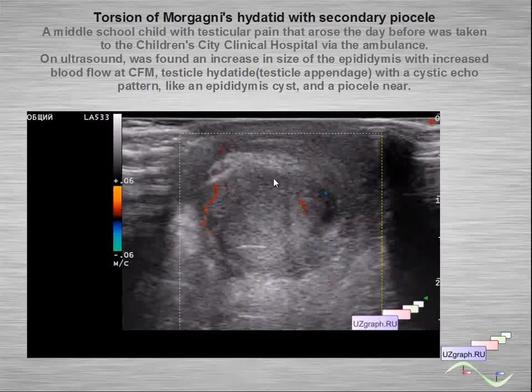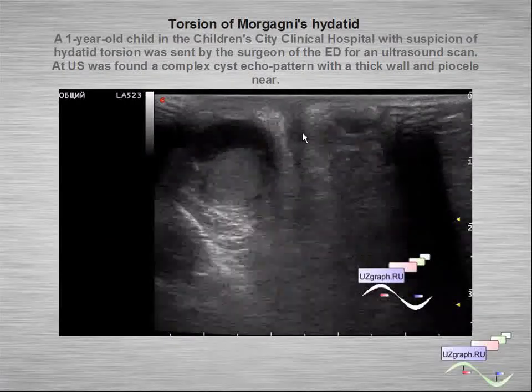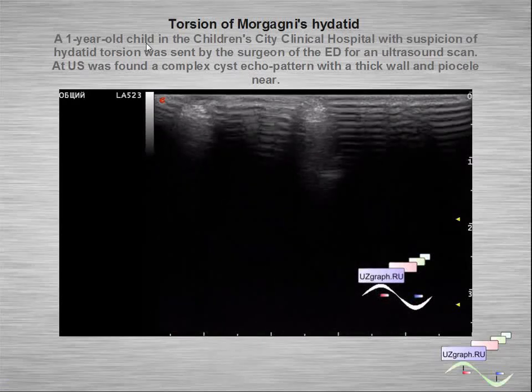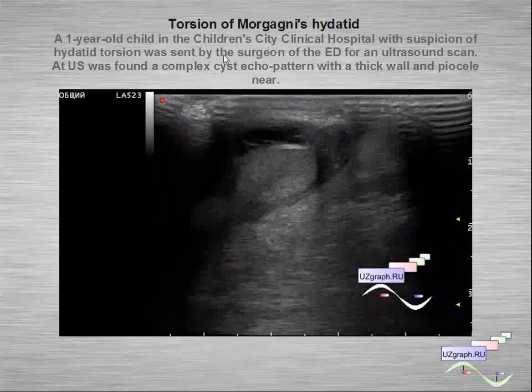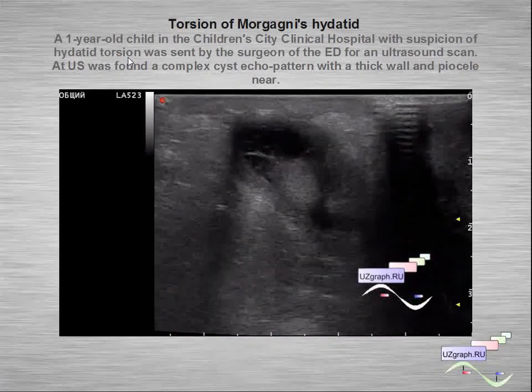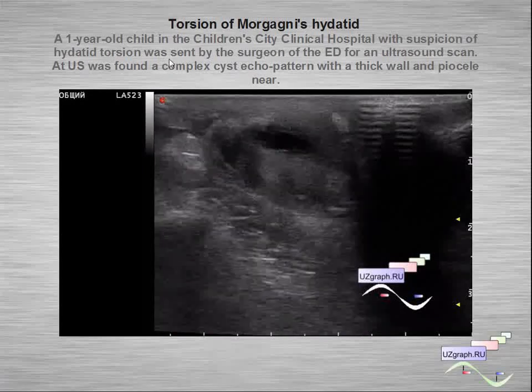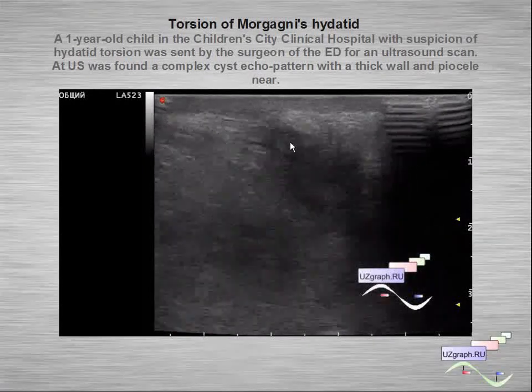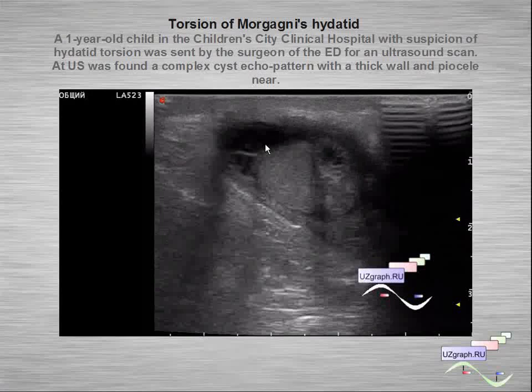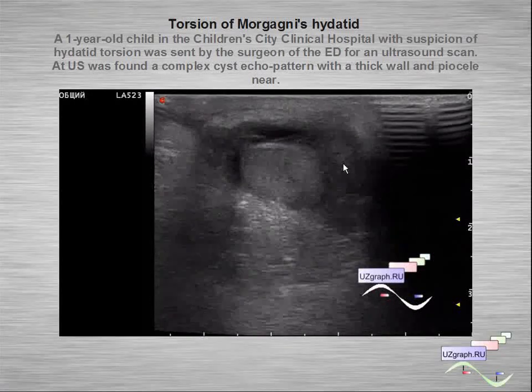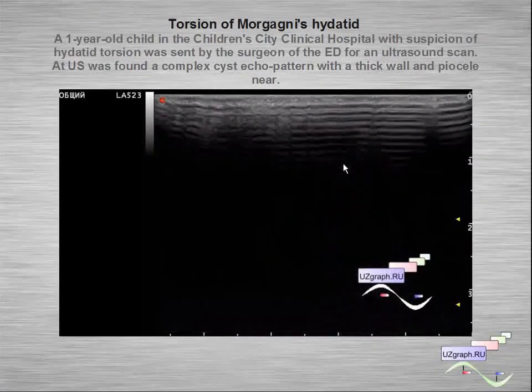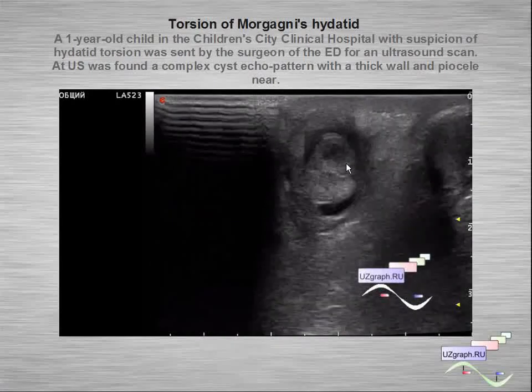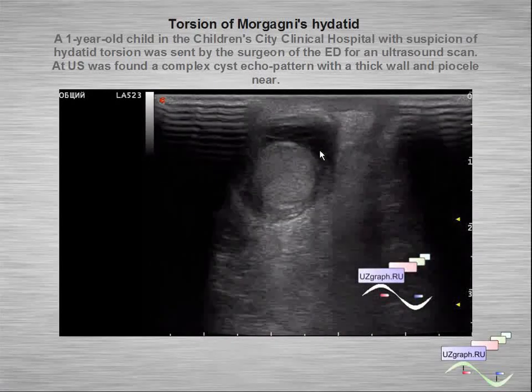Another example of torsion of Morgani hydatid — a one-year-old child with suspicion of hydatid torsion. We can see a complex cyst appearance of the hydatid.